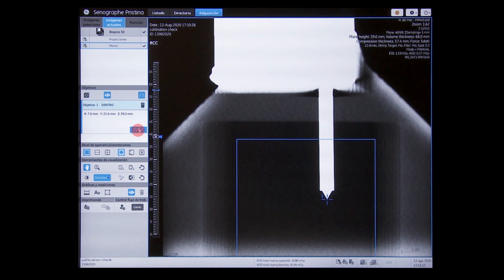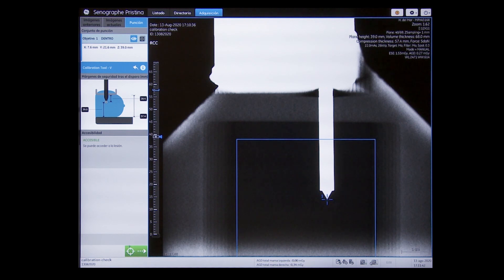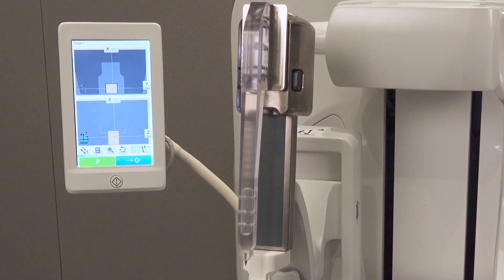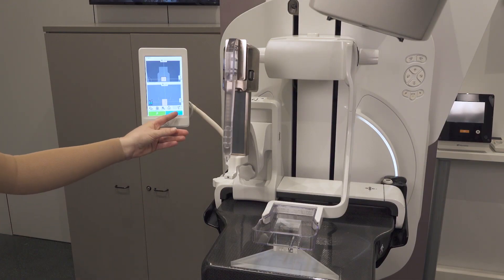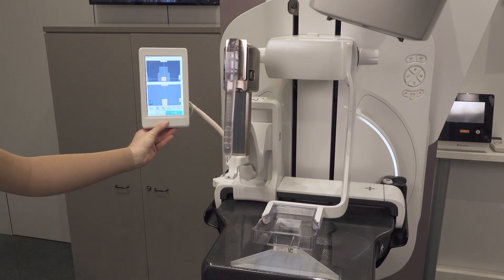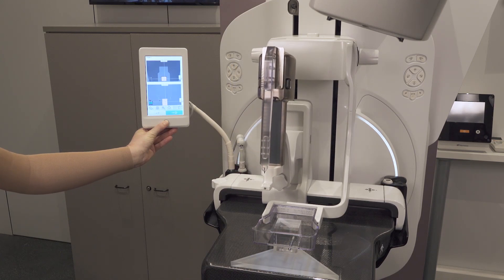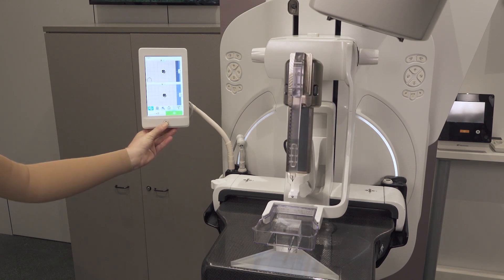Place the marker in the target. Select the calibration vertical needle, check accessibility, and send the coordinates. The calibration needle is already attached to the biopsy slider. The target button is highlighted in blue. Press the screen hardware button to drive the biopsy head to the target coordinates.